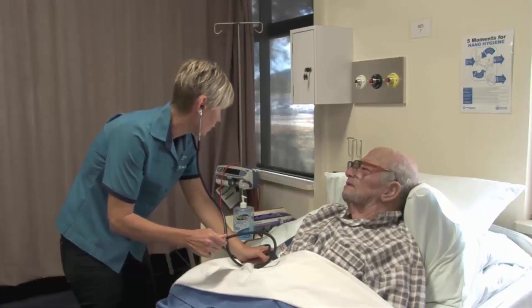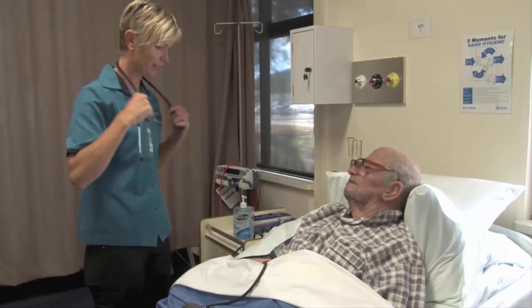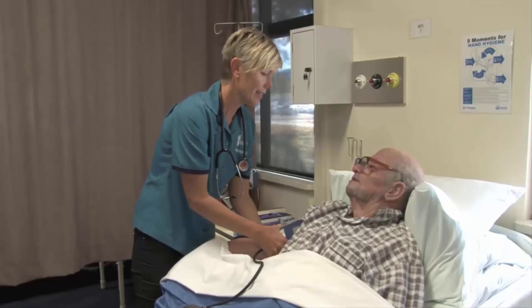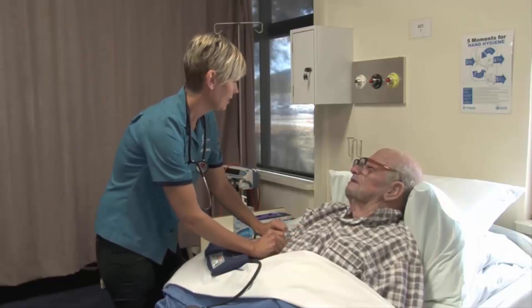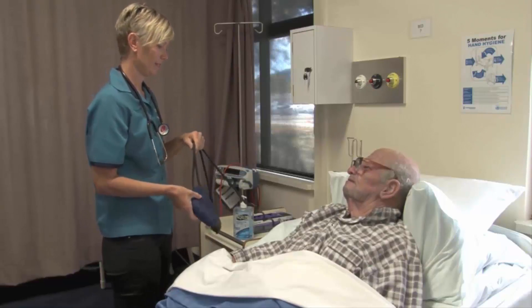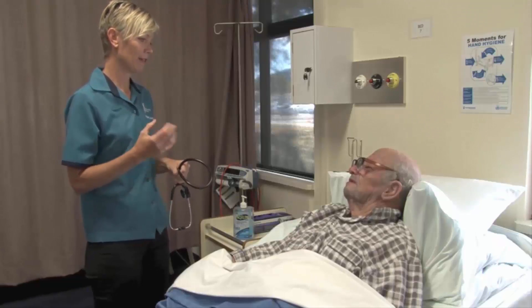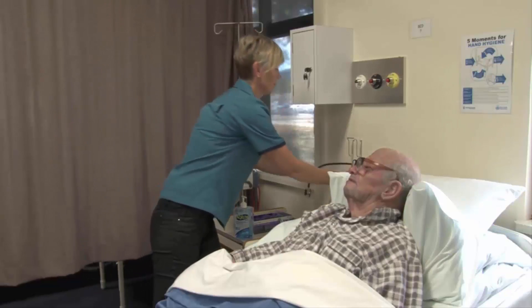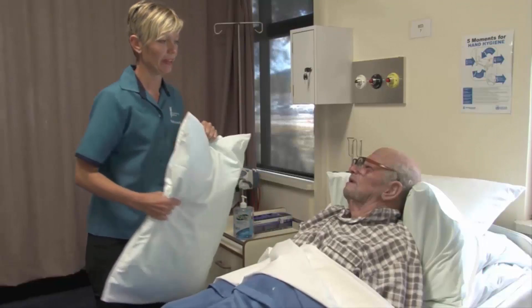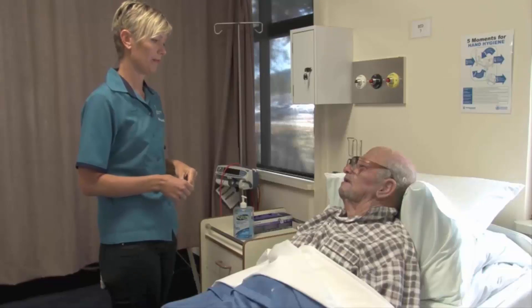160... and I let it down all the way until I'm positive of that last sound. That reading was 120 over 60. The first sound you heard is the systolic blood pressure and the last sound you heard is the diastolic. Are you ready for this word? Korotkoff sounds. The systolic is the maximum pressure in the vessels at any one time, and the diastolic is when there's the least amount of pressure — that's when your heart is relaxed and refilling. As the blood pushes out of the ventricles into the circulatory system, that maximum push is the systolic, and when the ventricles are refilling you have the least amount of pressure, which is the diastolic.